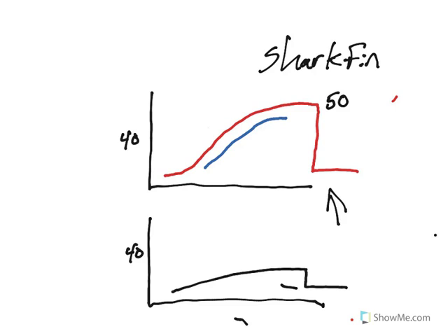What I look for in my end-tidal CO2 to determine whether this truly is shark finning is this lack of plateau. You can see this constant upward movement, and there's really no plateau in here. You see the same thing here, upward movement, and there's really no plateau. That's what I look for to make my determination that my patient is having bronchospasm.